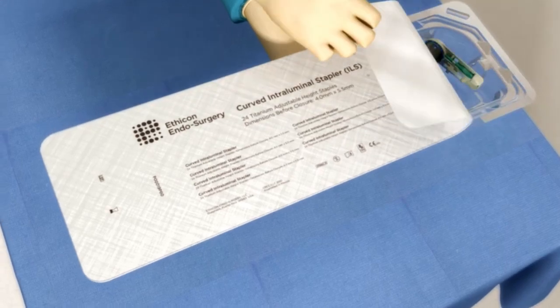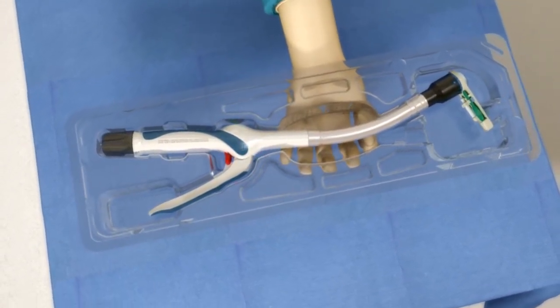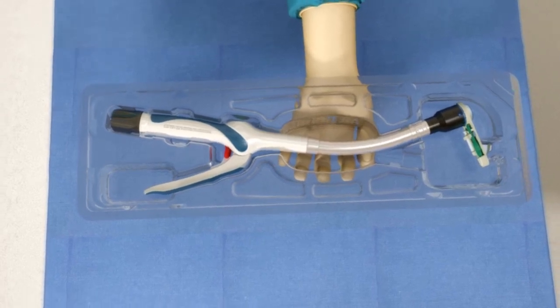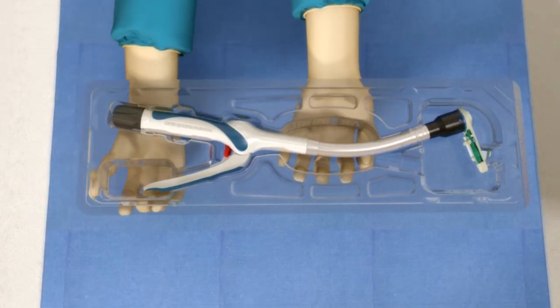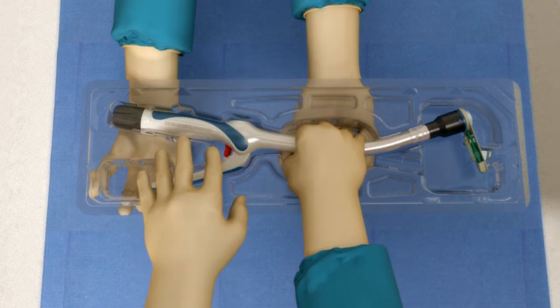Using sterile technique, remove the instrument from the package. To avoid damage, do not flip the instrument into the sterile field. Improved packaging design and grip surfaces facilitate the process.